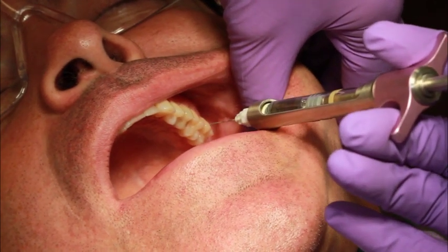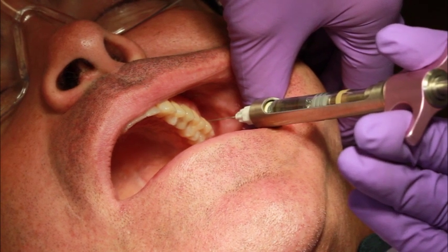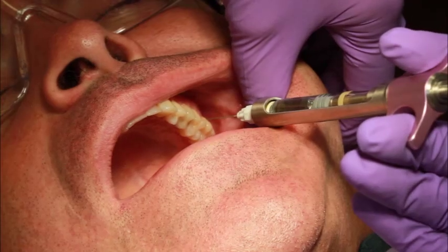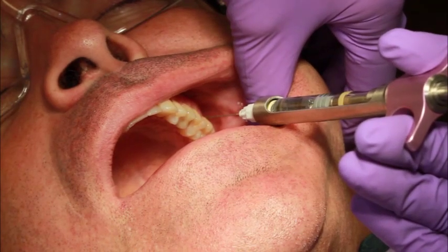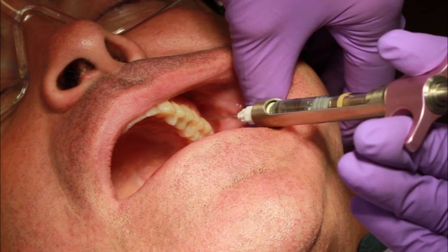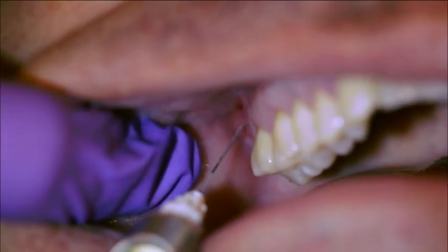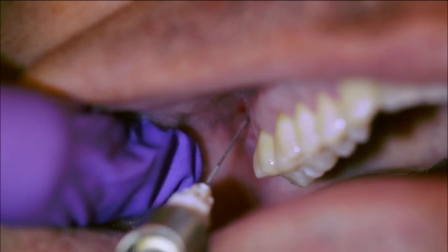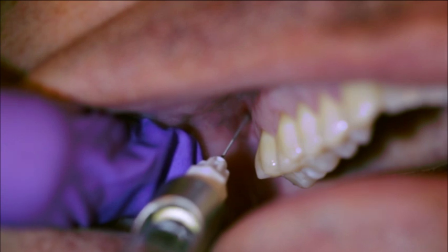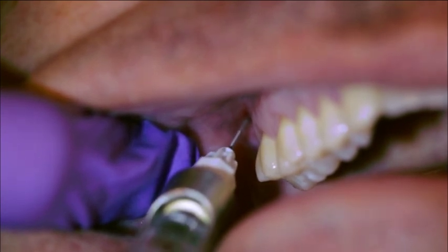However, the needle should follow the same pathway as the non-dominant arm, always toward the surface of the maxilla and the operator's body. Retract the cheek by pulling the tissue taut with the thumb for intraoral retraction and with the index finger for extraoral retraction. Insert the needle at the height of the mucobuccal fold superior to the apex of the maxillary second molar and gently advance it in an upward, inward, and backward direction until you achieve the desired depth of the needle.